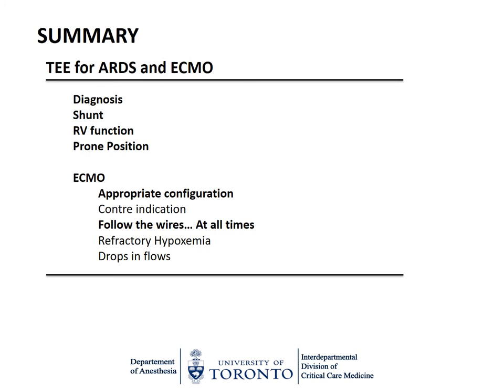And this is the summary. So really, echo is an integral part of the diagnosis of ARDS. It's going to be useful to rule out shunt, to assess your RV function. If you have to do a TEE while the patient is prone, it's actually safe. And once the patient is on ECMO, make sure that if you are guiding a procedure, you're following the wires at any given time, and echo will be really helpful to assess causes for refractory hypoxemia and drops in flows.